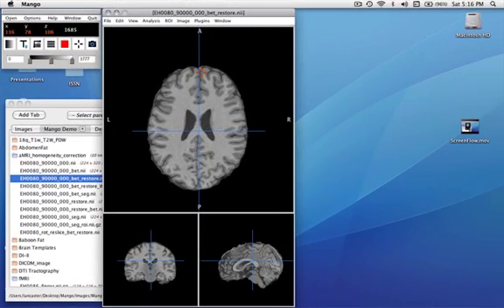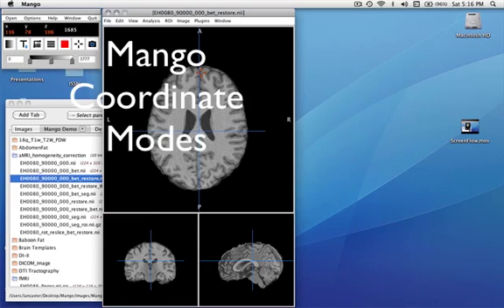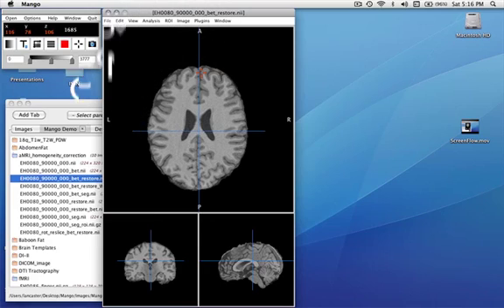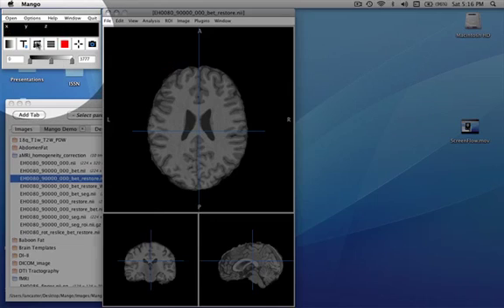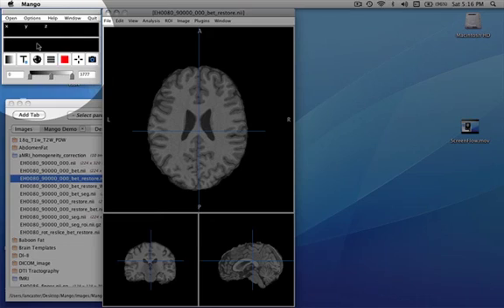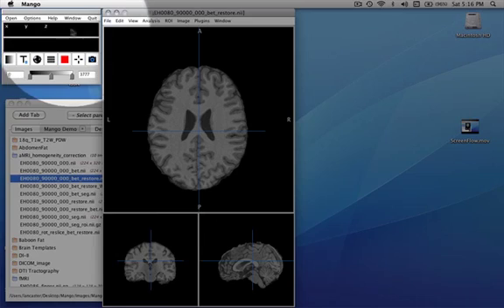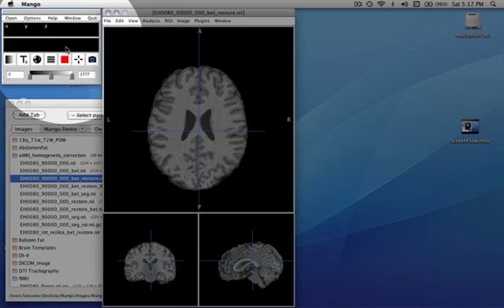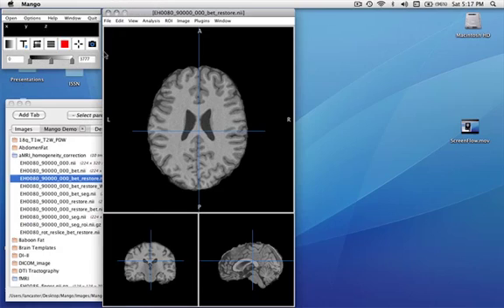I want to start by using this high-resolution image to explain the coordinate modes for Mango. Presently, we're in the image coordinate mode that's indicated by this icon. This icon, if you click it, toggles to world coordinate mode. Coordinate locations will be displayed here and additional information below. Let's go back to image coordinate mode and see what we get.